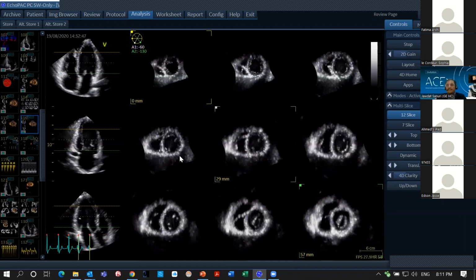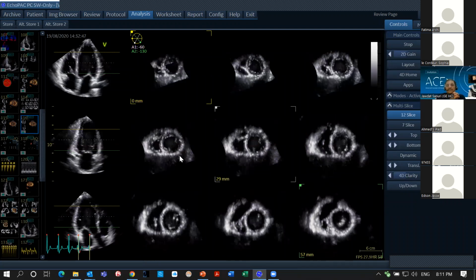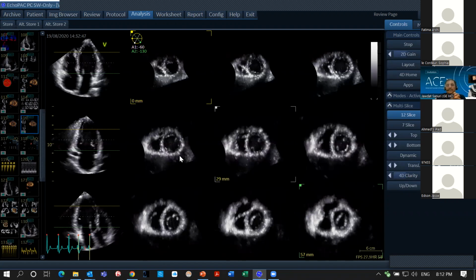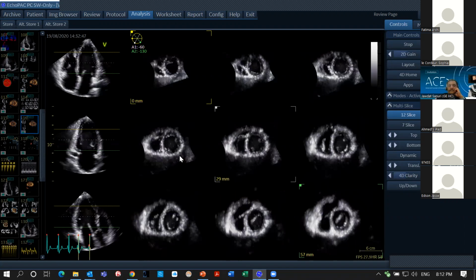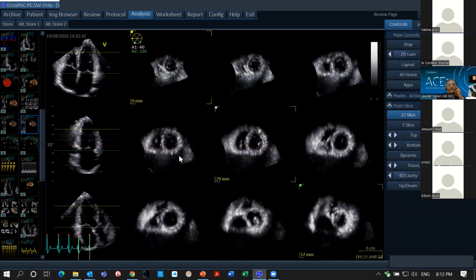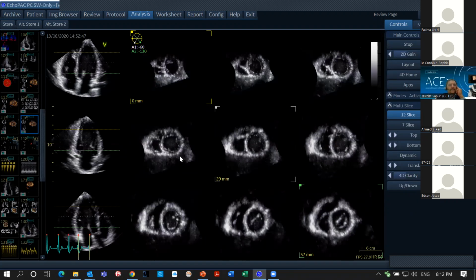Okay, I understand your point. The other thing, sorry, when I'm going to take the volume, after the volume, we see the volume and the values and everything. But when I go for acquiring images, it will be by the P2 because there is no option for the image store. So I can show the live acquisition. How can I do the image store with the live?